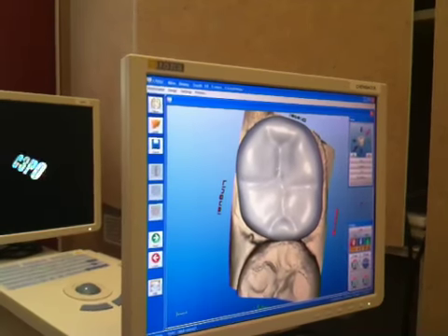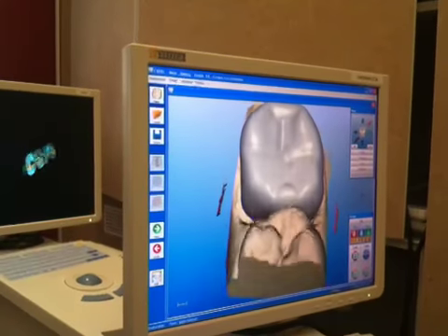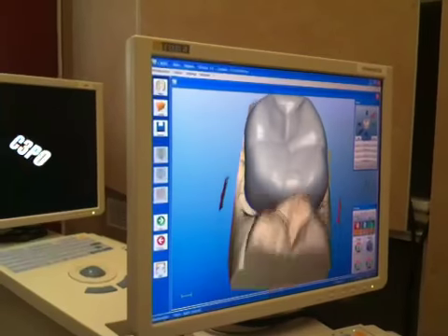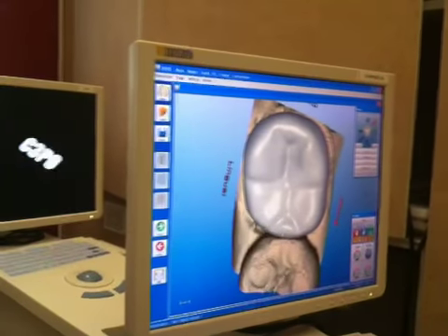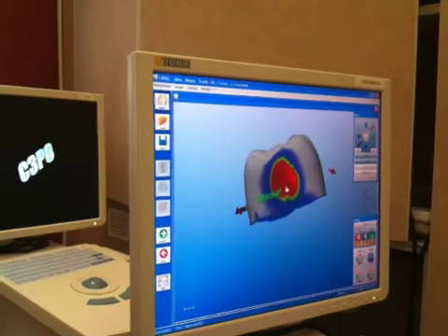And now I'm just smoothing it out so it doesn't look so much like lines that we've drawn. And now you can see when we turn it on end that all of a sudden we have these functional cusps. Mm-hmm. Okay. Cool.